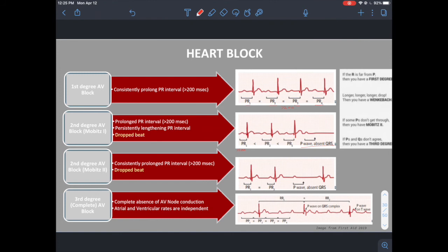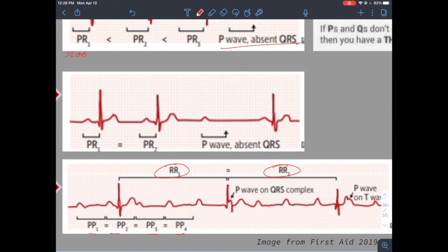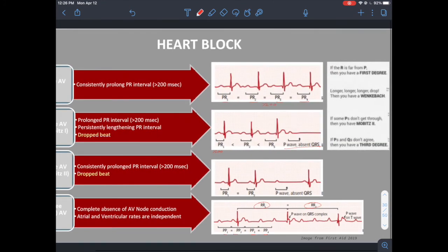Second degree Mobitz II heart block: PR interval is greater than 200 milliseconds and consistently prolonged — always the same duration — with a dropped beat. In complete heart block (third degree), there is absence of AV nodal conduction: different atrial and ventricular rates, P waves not followed by QRS complexes, and no one-to-one correspondence. You can see P-P intervals at one rate and R-R intervals at a separate, independent rate — the two are completely dissociated.